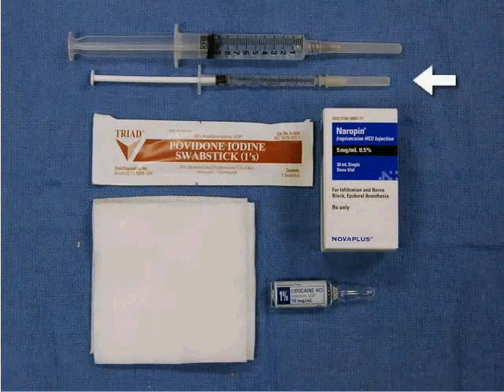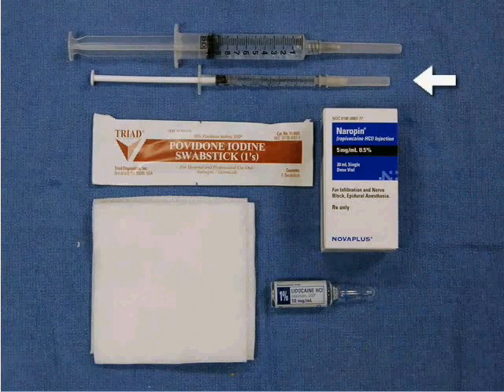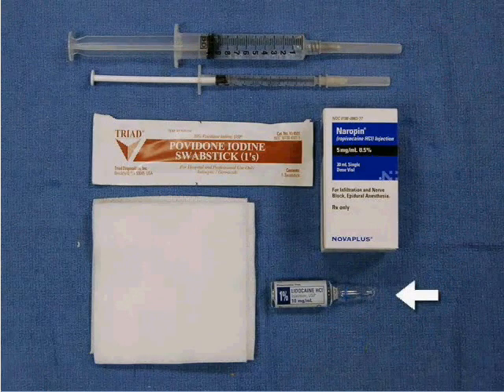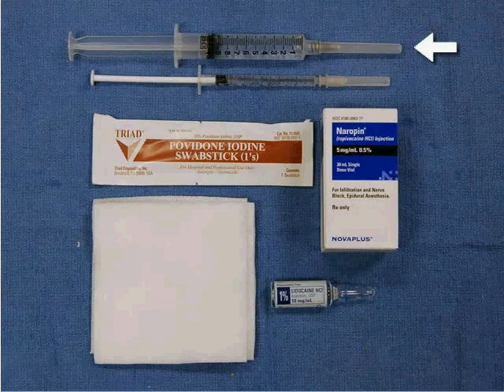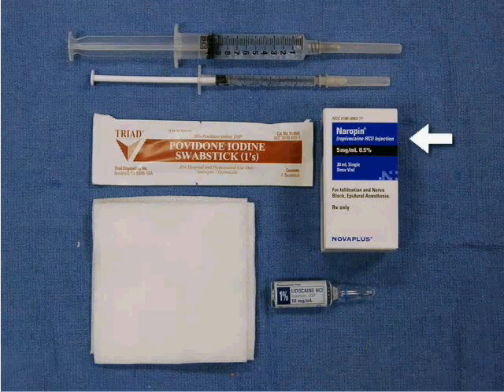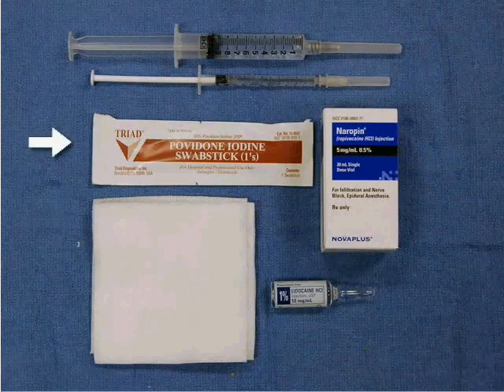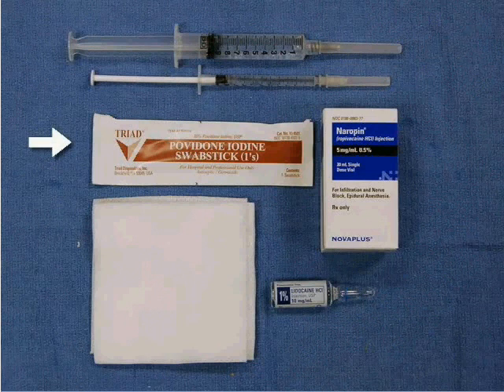Prior to initiating the saphenous nerve block, obtain a tuberculin syringe with half-inch 25-gauge needle, 1% lidocaine, a 10-milliliter syringe with 1.5-inch 22-gauge needle, 10 milliliters of the local anesthetic of your choice, gauze, and a povidone-iodine swab.